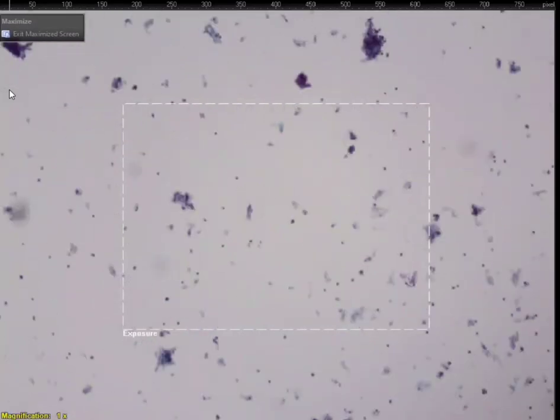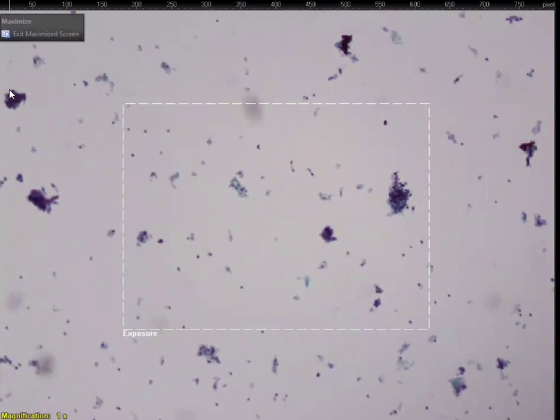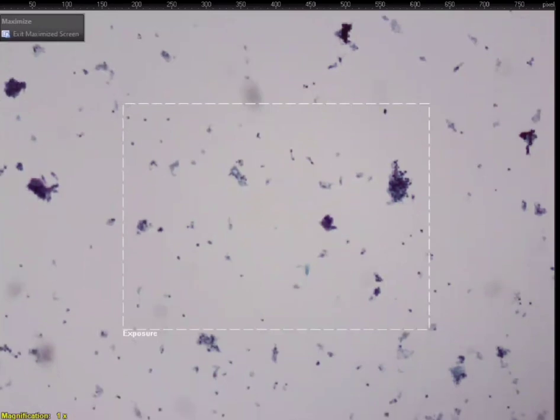Maybe canalization to lung. Sorry, what? A fistula. Does that happen? Not usually with lung. Not common in lung. Sometimes an abdominal fistula, yes, that can happen, but not common with lung. But a needle goes through lung, right?